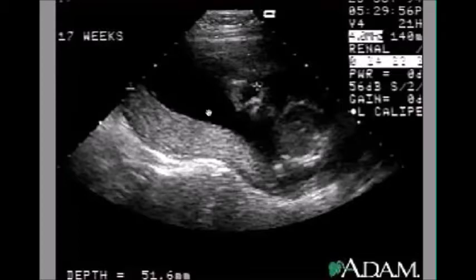Again, black is amniotic fluid. Here's the baby's head. This is the placenta. This one is posterior. So it's much deeper down below. Skin is here. So this is towards the back of the mother. So this is called the posterior placenta.